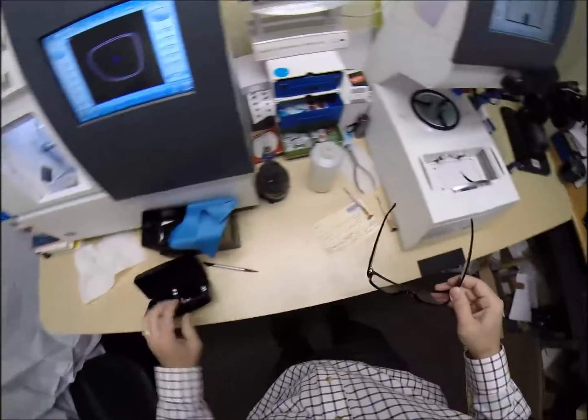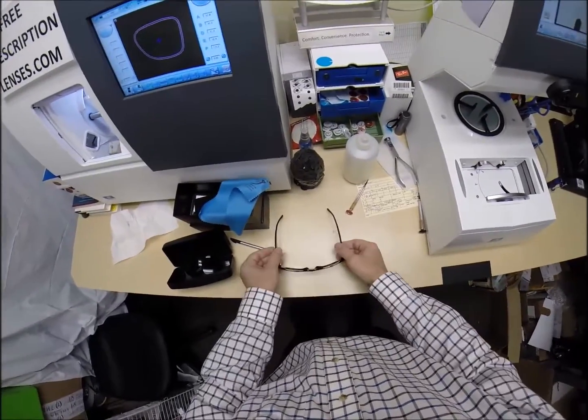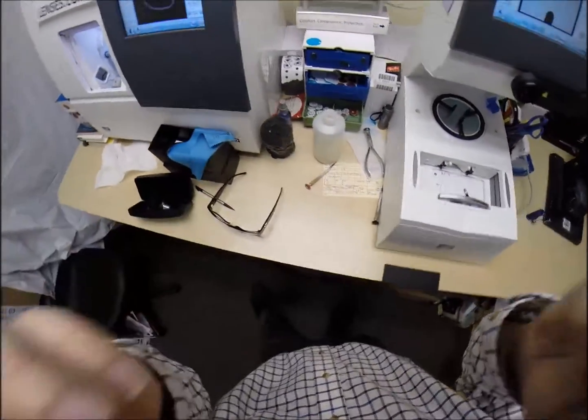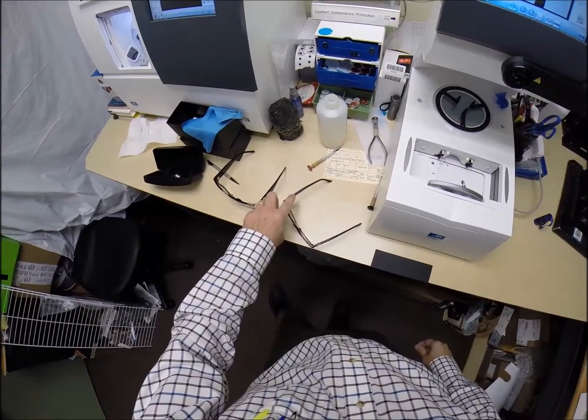Let me move that out of the way for a second. Set this down on the counter. Well, let's start this way, and press down. There is no wobble. When I say wobble, I'm part of that 80%. When I take mine off, they wobble on the counter, but they sit level on me.